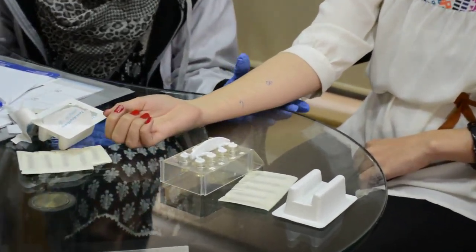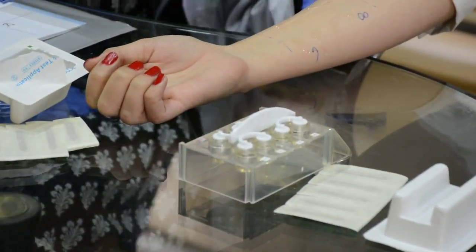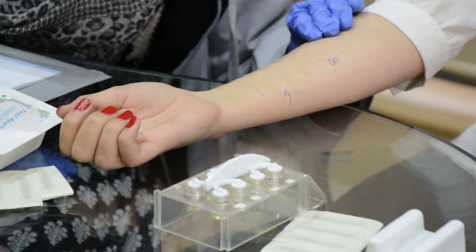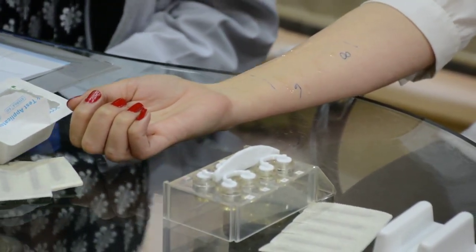Where there is a localized allergy reaction, you may see a red, itchy and swollen lump called the wheal. This wheal diameter is measured in grading of allergies done by the doctor.